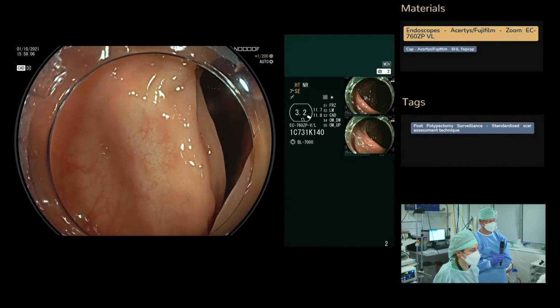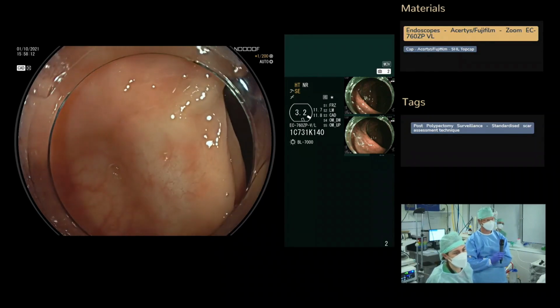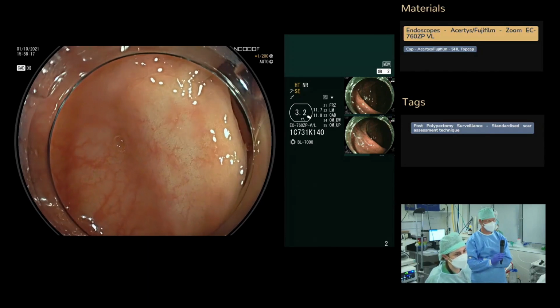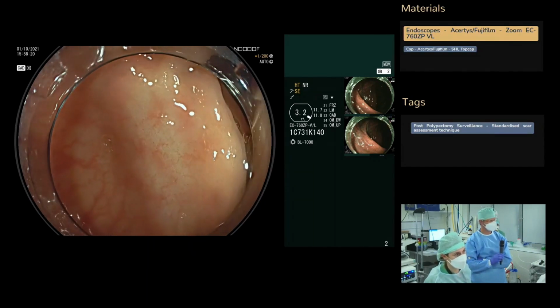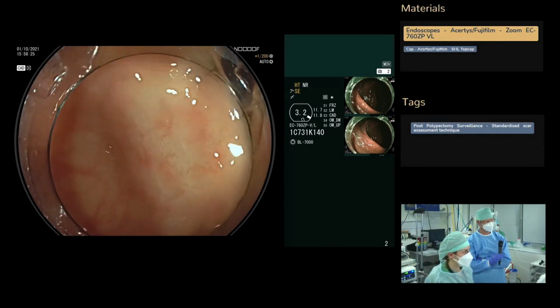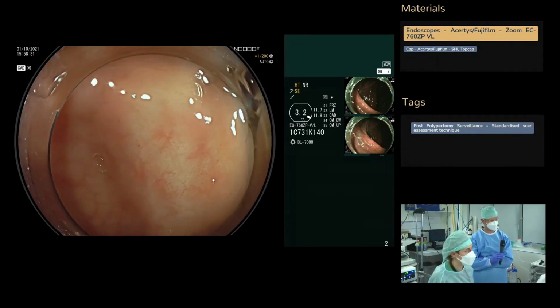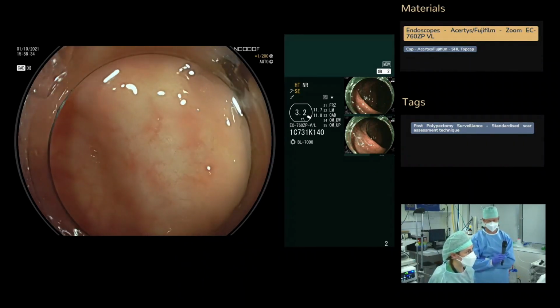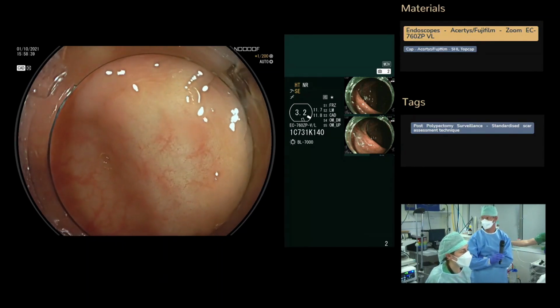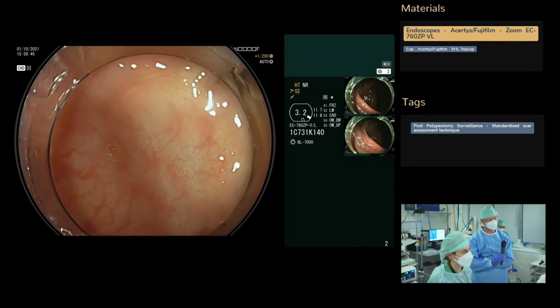You may have heard before that, for example, snare tip soft coagulation on the margin of the defect after piecemeal EMR, you would not do without having injected that margin, right? So that is not safe. But as you said just then, because of the fibrosis, it's definitely much safer. However, depending on how much you burn, even though it might seem superficial, we do often clip those areas.